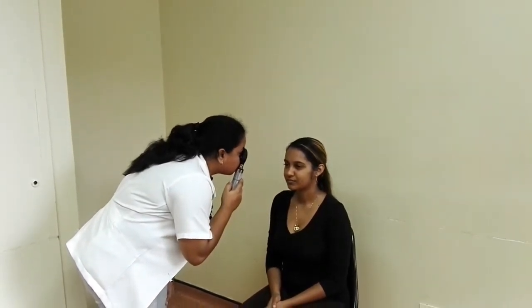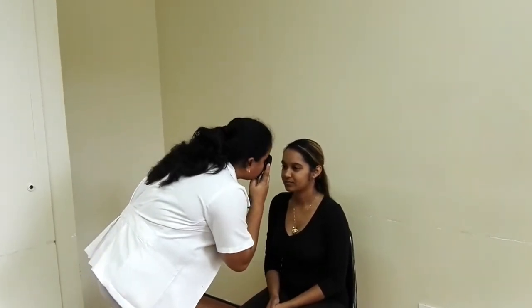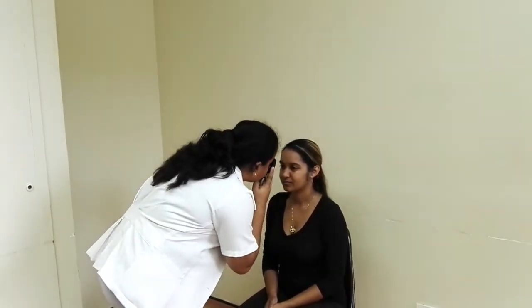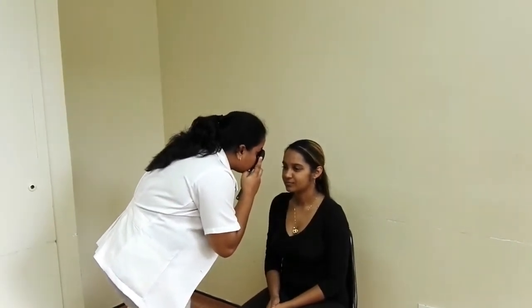The plus 10 setting on the direct ophthalmoscope is used to better visualize the eyelids and eyelashes. The position of the eyelids is noted, looking bilaterally for ptosis, as well as signs such as trichiasis, redness, swelling, and growths at the lid and the lid margin.